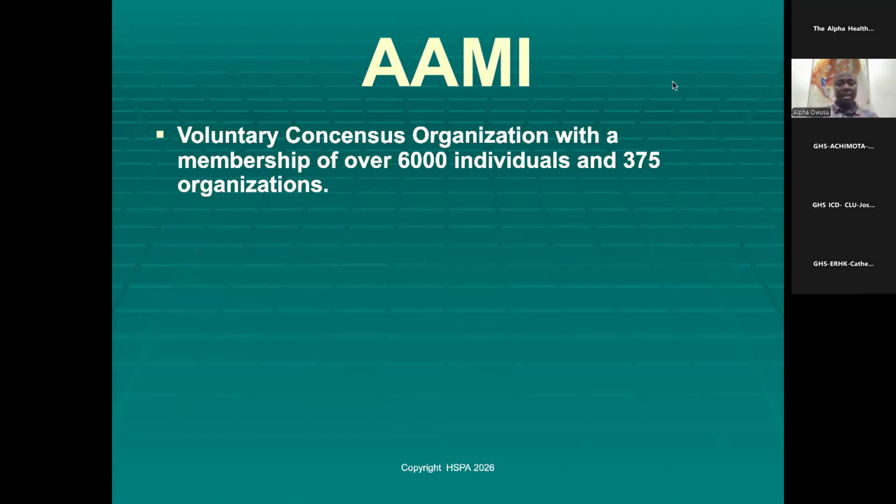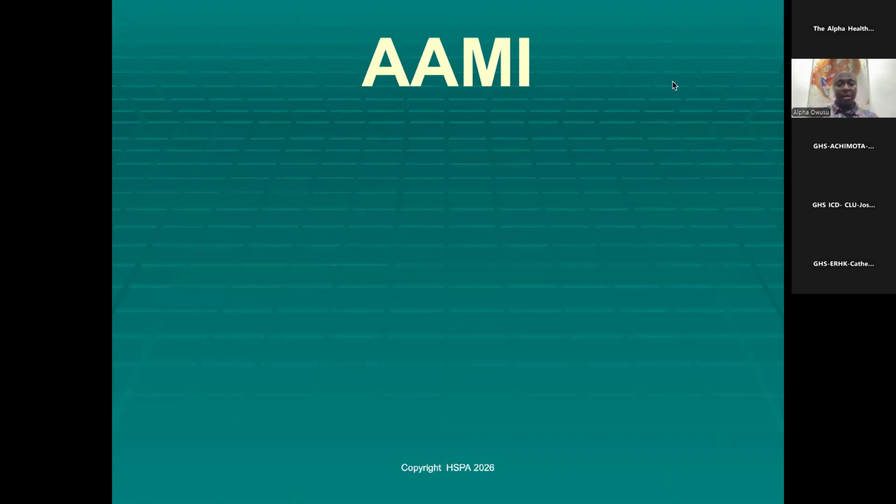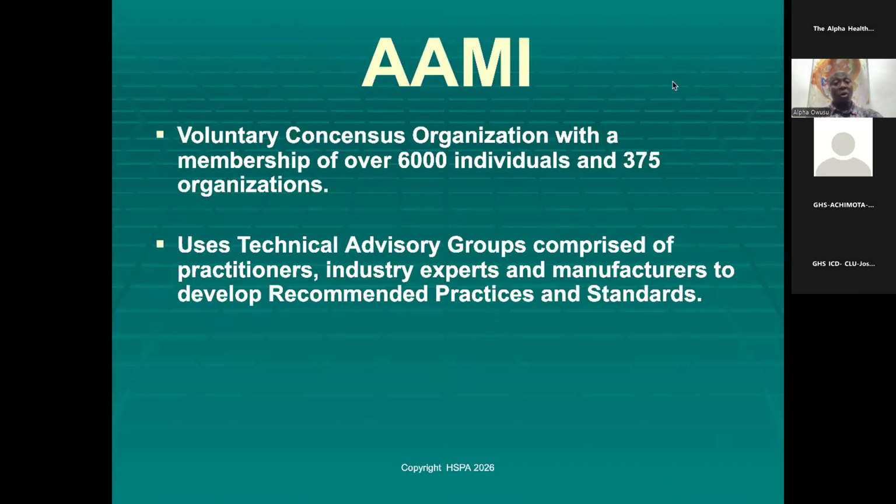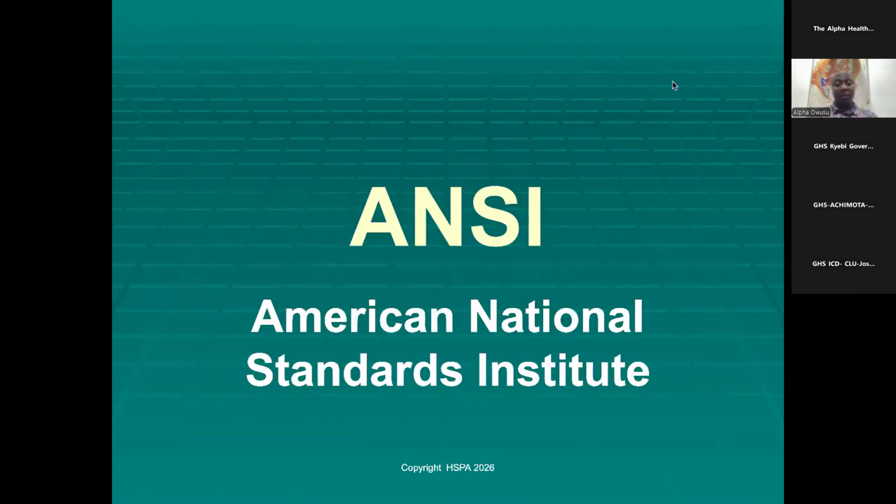Association for the Advancement of Medical Instrumentation. And the biomed team, they have to know this. Very, very important. And then ANSI, the American National Standards Institute. And so you always see ANSI AAMI, ANSI AAMI, because it is American.